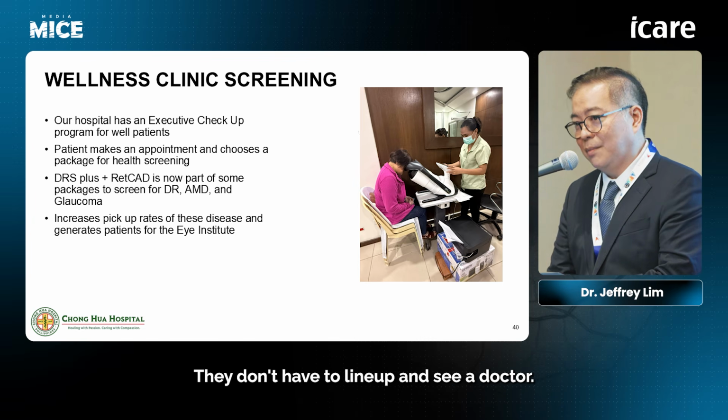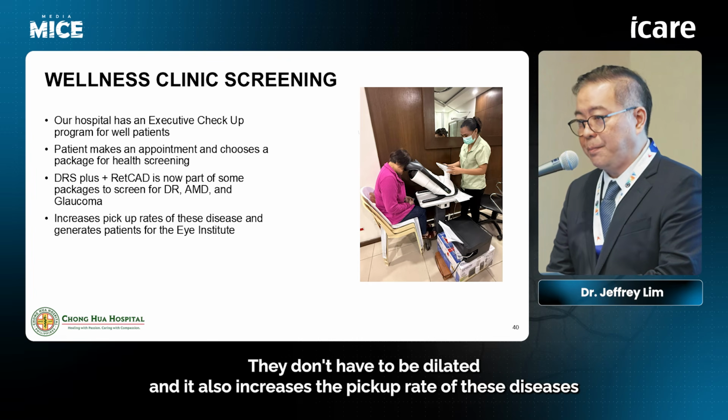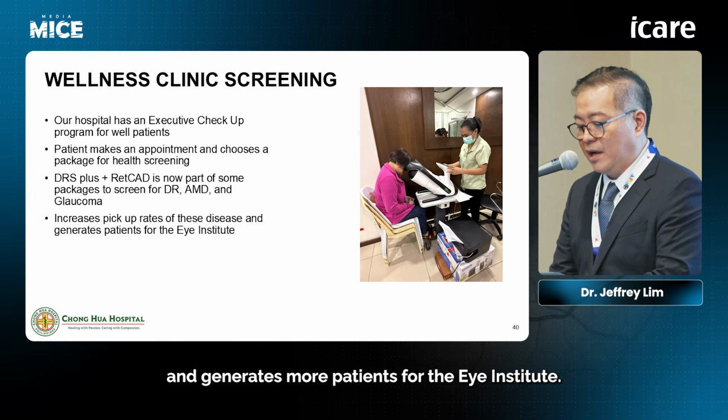This is very useful, and a lot of the patients find it very useful. They don't have to line up and see a doctor. They don't have to be dilated. And it also increases the pickup rate of these diseases and generates more patients for the Eye Institute.